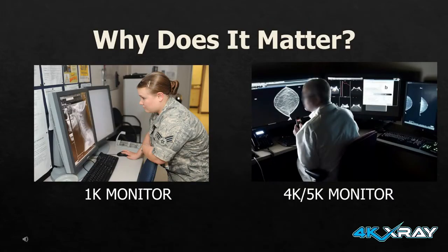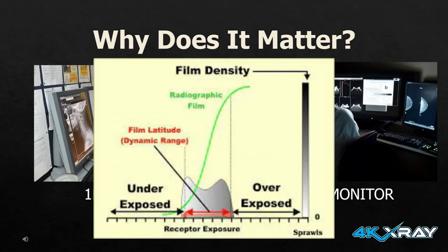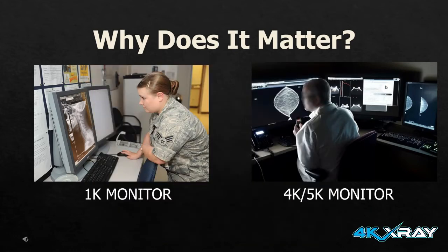So why does it matter so much in the digital world? Remember, in the past, we had such a narrow latitude of exposure. Making the image lighter or darker was definitely a challenge. However, today with the reprocessing and rescaling and the lookup tables, there's a much wider latitude of range.